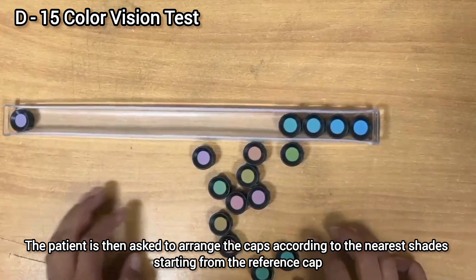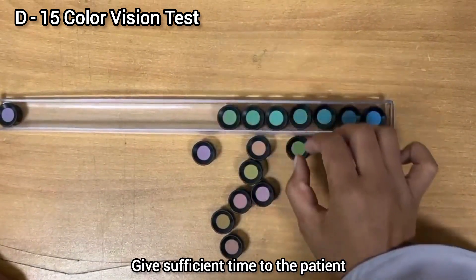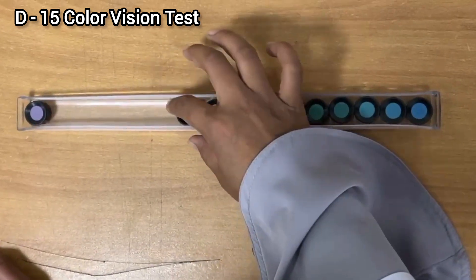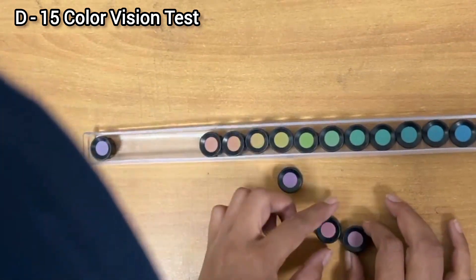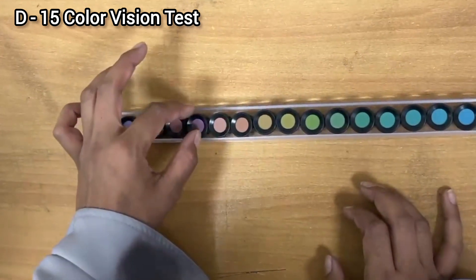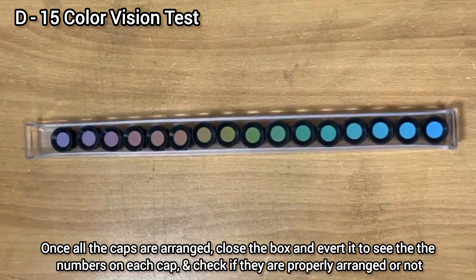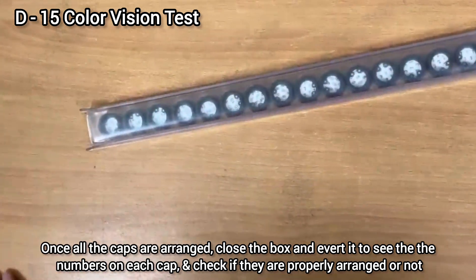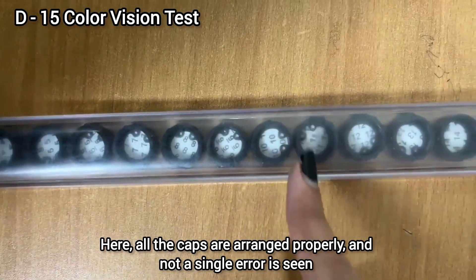You have to make sure that the illumination of the room is very good. If the patient is wearing any prescription glasses, it is very necessary for the patient to use those glasses during the test. You have to guide the patient to arrange the caps according to the hues they can identify. Shuffle all the caps to avoid any cheating or hints for the patient, then ask them to arrange the caps. When they are done, close the tray and check whether the sequence they have arranged is correct.